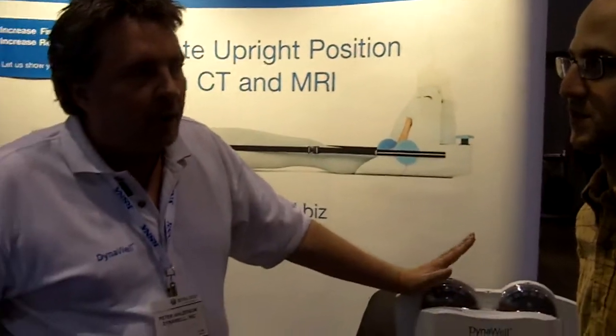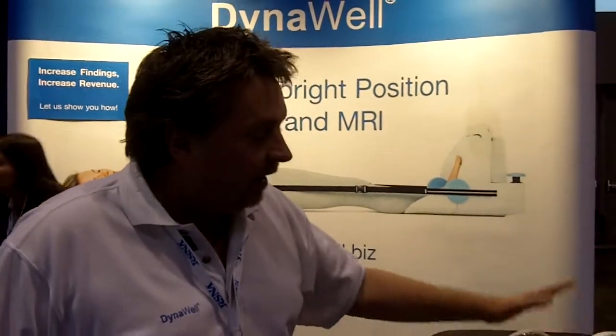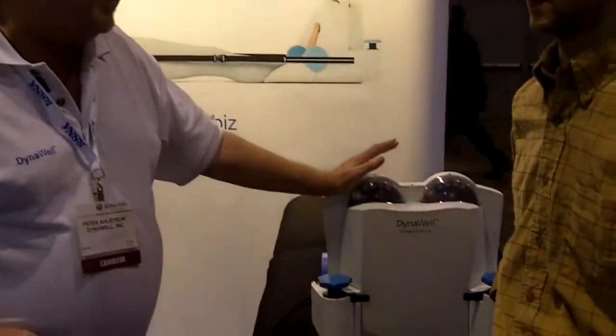People with sciatica or people with neurogenic claudication who can't walk more than maybe two blocks, two and a half, and then get limited to pain, are benefiting from this probably up to 70 percent.